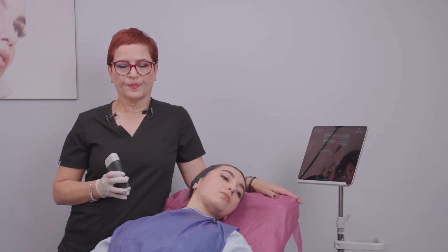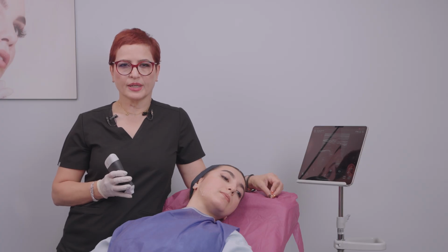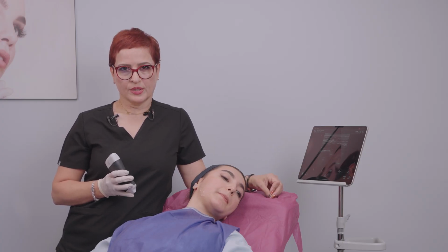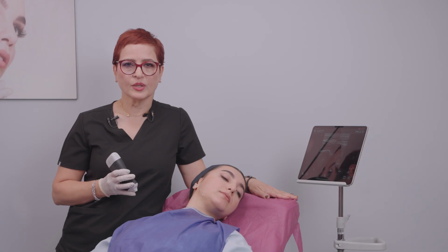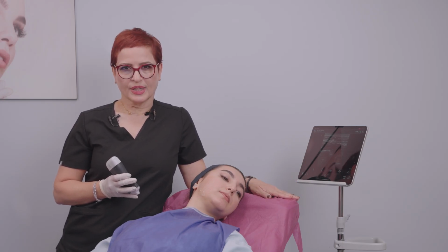In today's scanning, I showed you how to assess the buccal fat pad for surgical or non-surgical treatment to ensure patient safety, to give the patient precise and safe treatment, or even exclude your patient from the treatment.